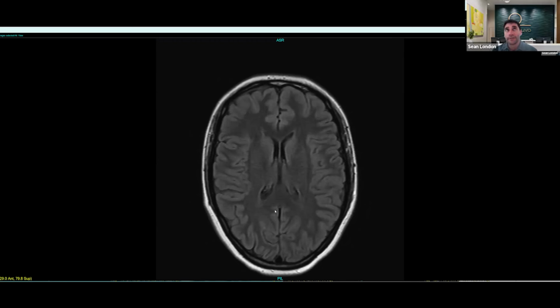And when you get into the smaller parts of the body, like the hands and the feet, to really get a detailed assessment, you need to do dedicated imaging with dedicated coils. We're using body coils with a neck and head coil, whereas these coils are specialized to provide the best signal for interpretation or best image acquisition of those particular areas. So it's just one of the limitations that we have currently with technology.